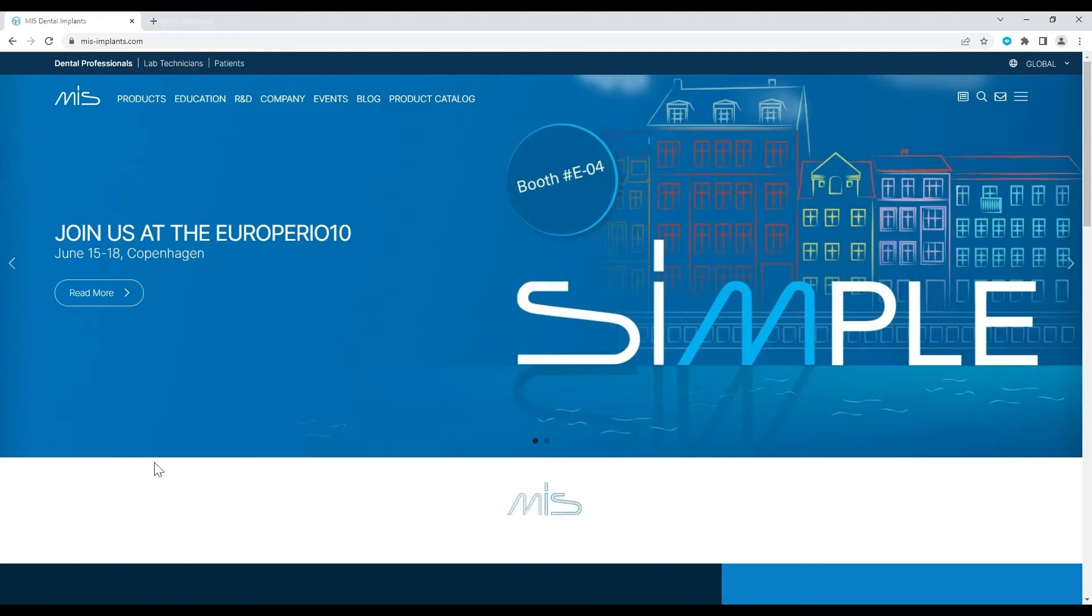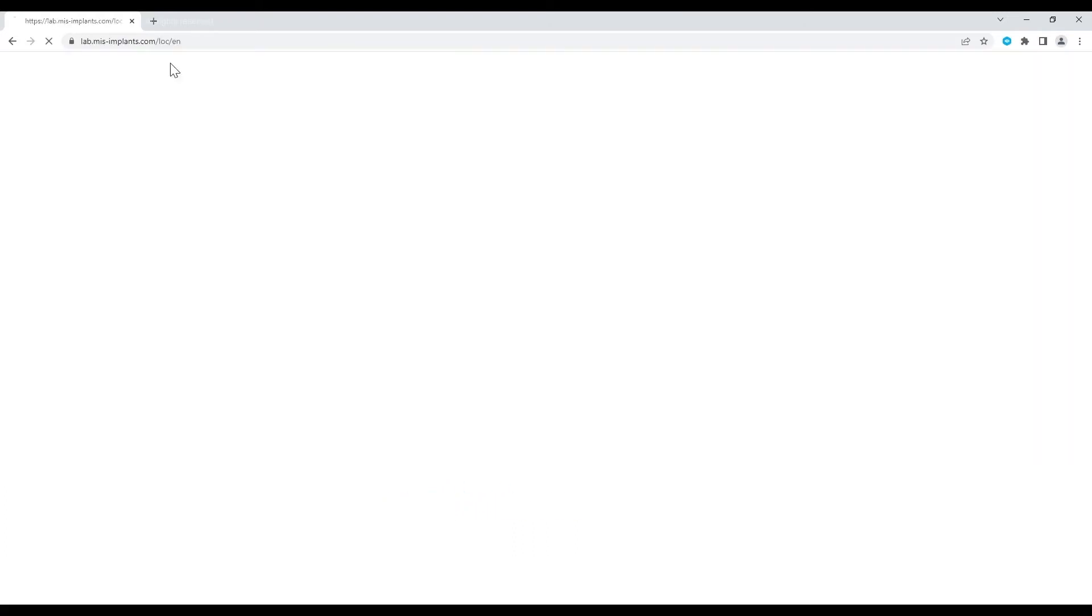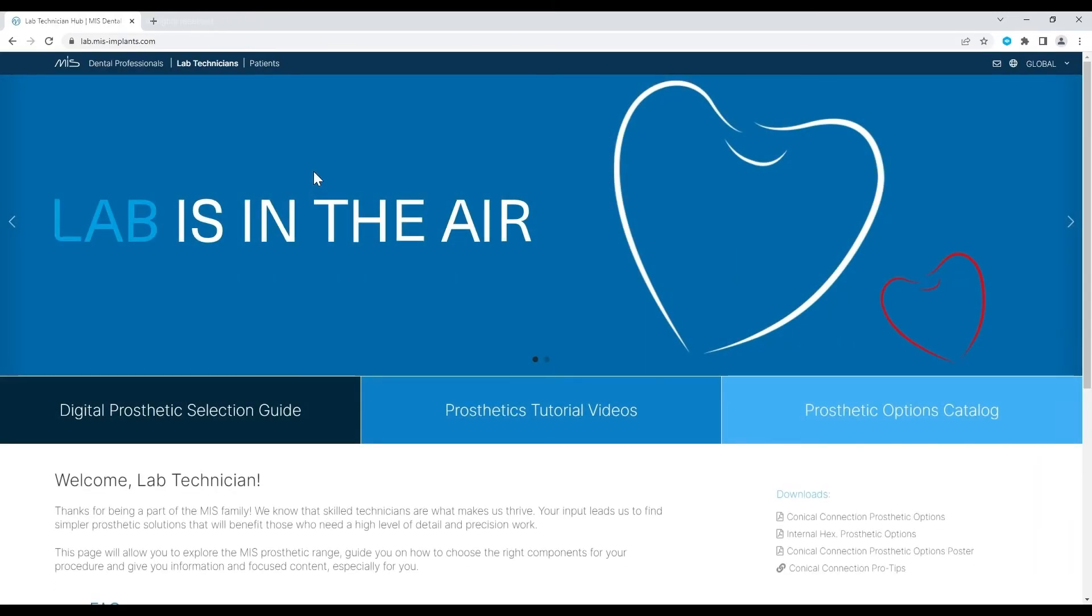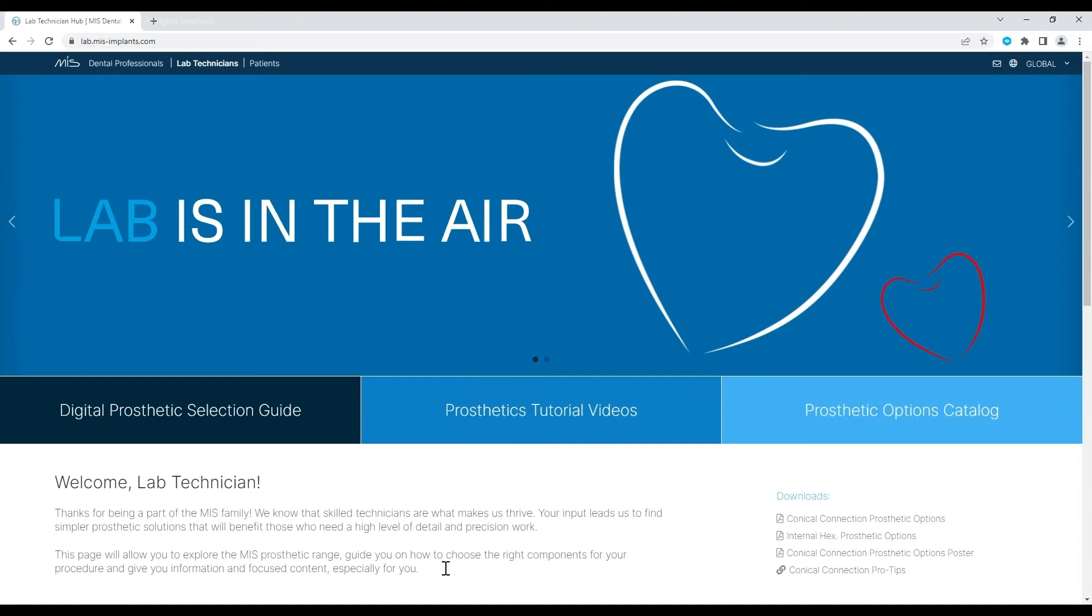You may find the link to the Prosthetic Selection Guide on the MIS website. We'll demonstrate the selection process with a digital workflow.